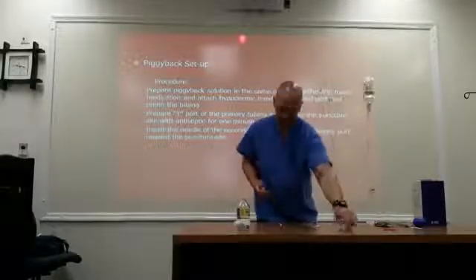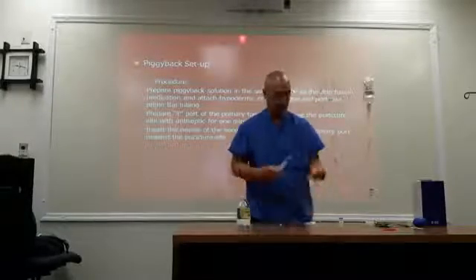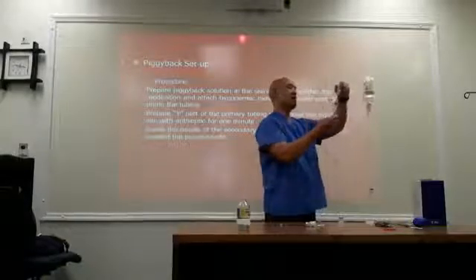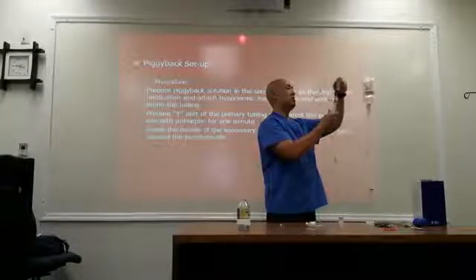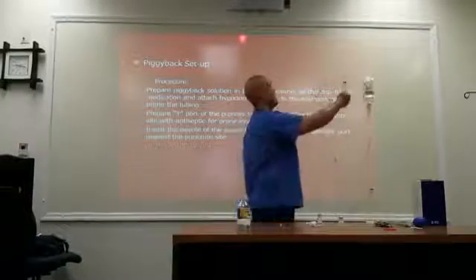Use one and the one right behind the big one. Okay, so I'm going to get some more. Remember, single use only. So I got more fluids. Okay, I'm purging the air out.